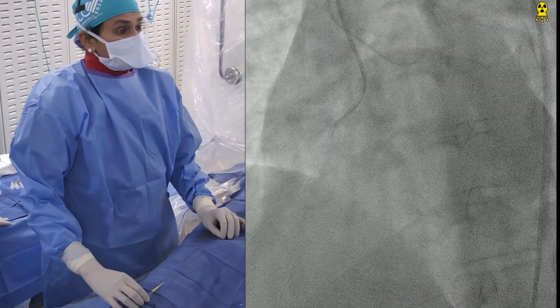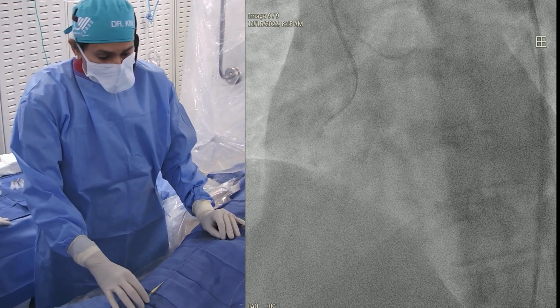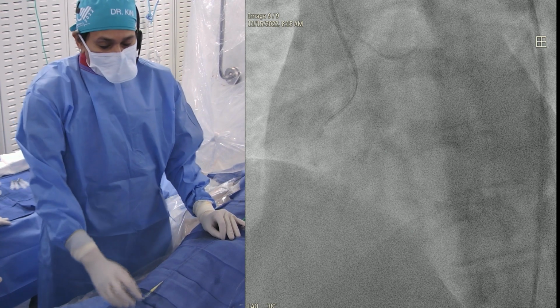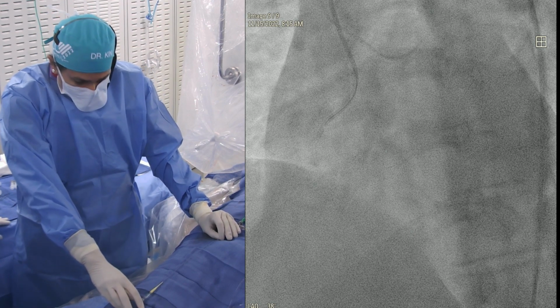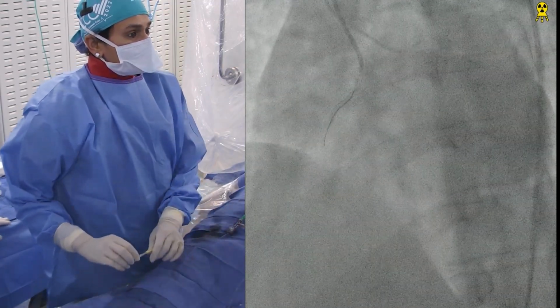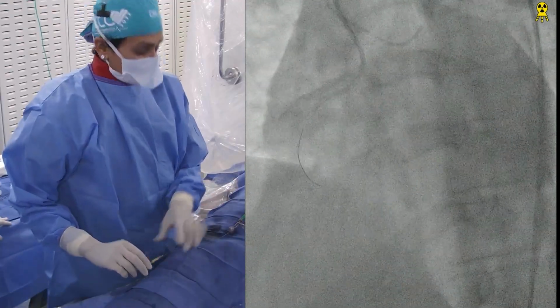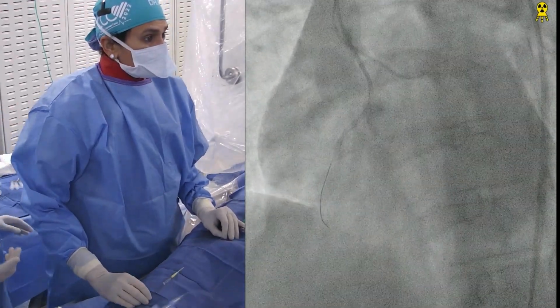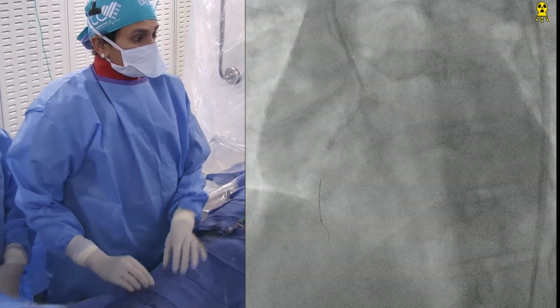And another question is, should you have gone with a left-sided guide also, in case you fail with the right, to go with the retrograde collaterals, retrograde injection. We have a long sheath, we just didn't go with the guide. But 6 French, we are always worried about dye use, so we try to minimize the dye load. So basically, if you need to, you will change the guide on the left side if we cannot succeed antegrade, correct? Yes. So therefore the 6 French sheath is there, and we don't have to worry about increasing the sheath size. It's only changing the guide. And we all know that guides are definitely more obstructive to the vessel compared to a 5 French diagnostic. So if not necessary, you don't need to.